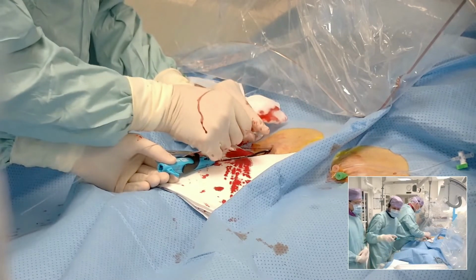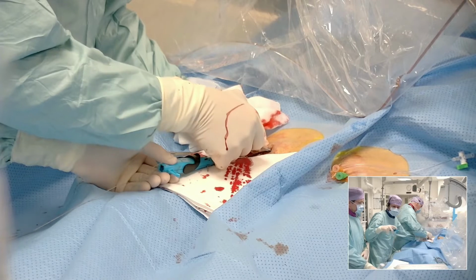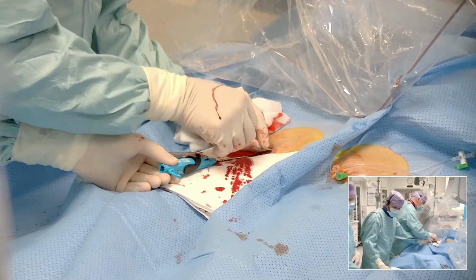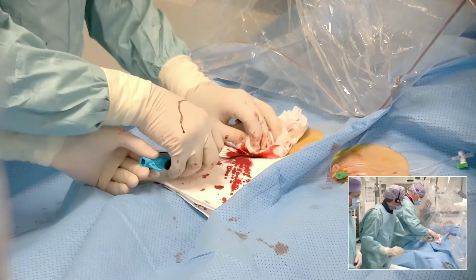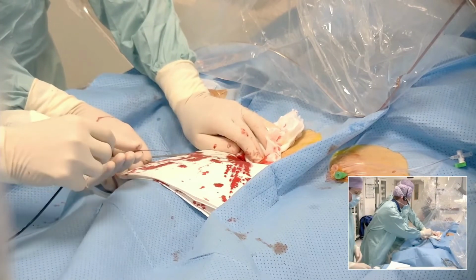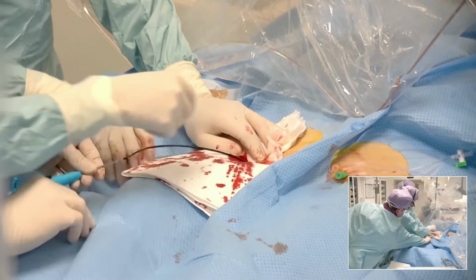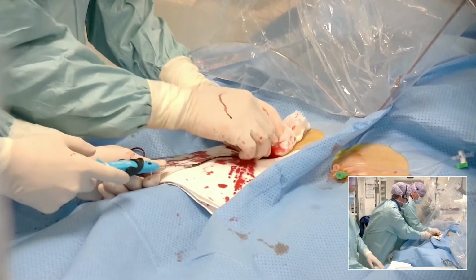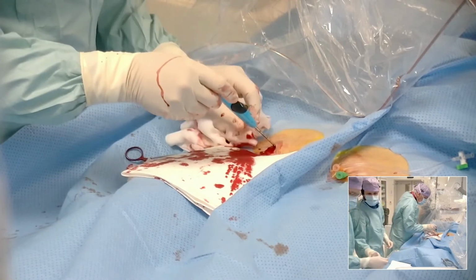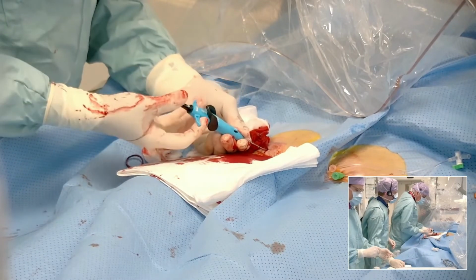Third, this tool to cut your suture has been increased a bit in height, so it's easier to catch your suture and cut it. And then lastly, okay, let's remove, and in the meantime, it has become a little bit even more hydrophilic and easier to introduce. So again, we're going to use 2 ProStyle devices here. Okay, bleed back. And then we're going to shoot the needle.